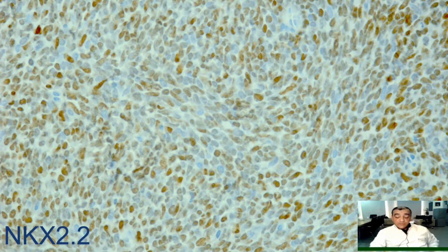But in case we have positive CD99, a specific morphologic picture such as small blue round cell tumor, with positive CD99 membranous staining, this positive staining of NKX2 promptly pushes pathologists to the possibility of a diagnosis of Ewing sarcoma.